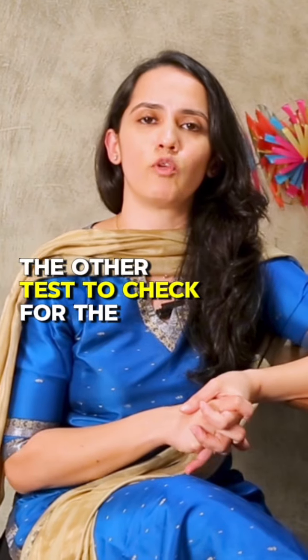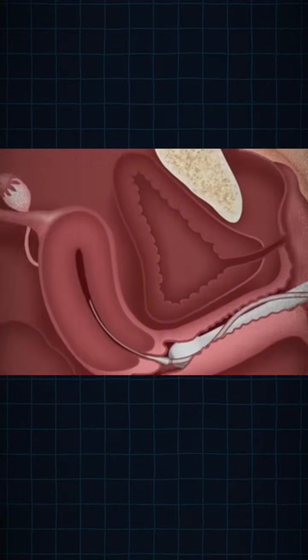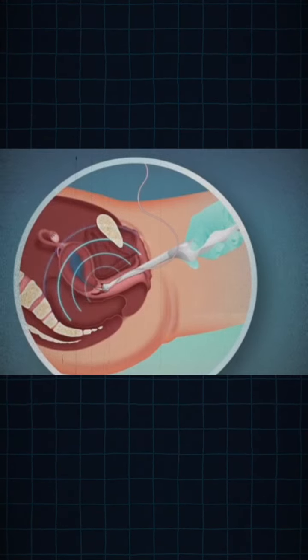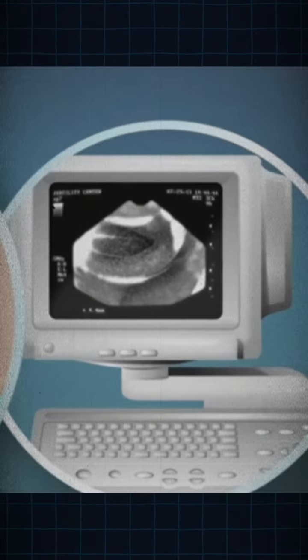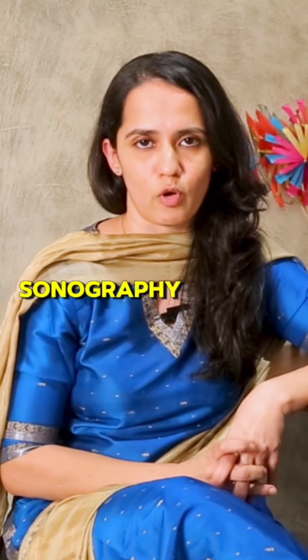The other test to check for the uterus or the uterine cavity is doing a saline infusion sonography. In this, a catheter is passed through the vagina, through the cervix into the uterus, and some saline is passed, which causes distension of the uterine cavity. So if there are any problems inside the cavity, like a polyp which is hanging inside, we can see it on the saline infusion sonography.